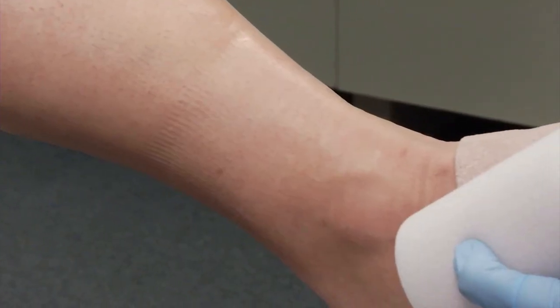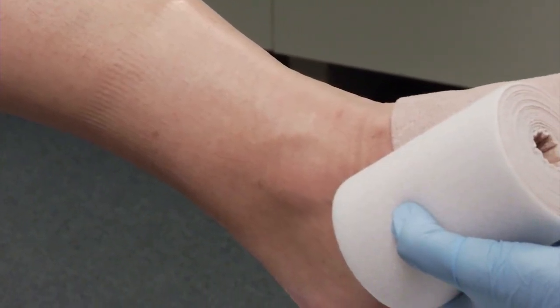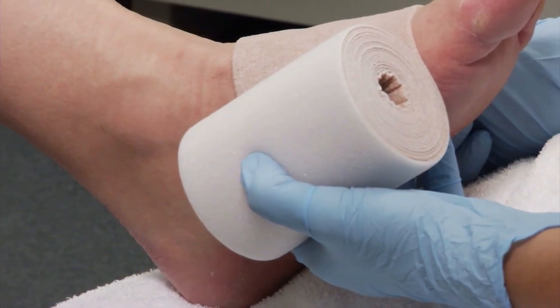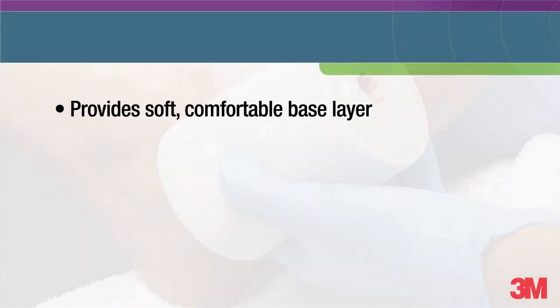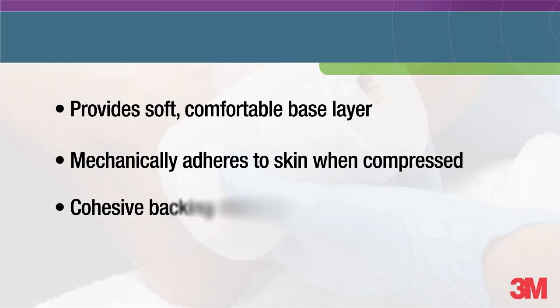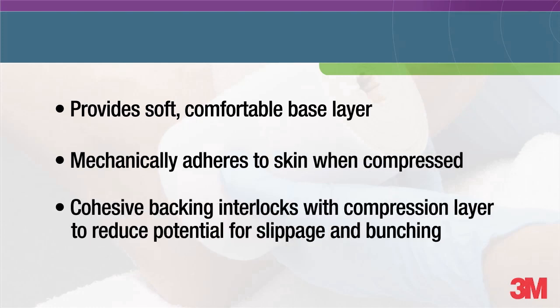Apply the comfort layer with the foam side towards the patient's skin, with just enough tension to conform to the shape of the leg. The comfort layer provides several proven benefits: it provides a soft comfortable base layer, it mechanically adheres to the skin when compressed, and the cohesive backing interlocks with the compression layer to reduce the potential for slippage and uncomfortable bunching at the ankle. The foam layer is permeable and will evaporate skin moisture, but is not intended to be a primary wound dressing.